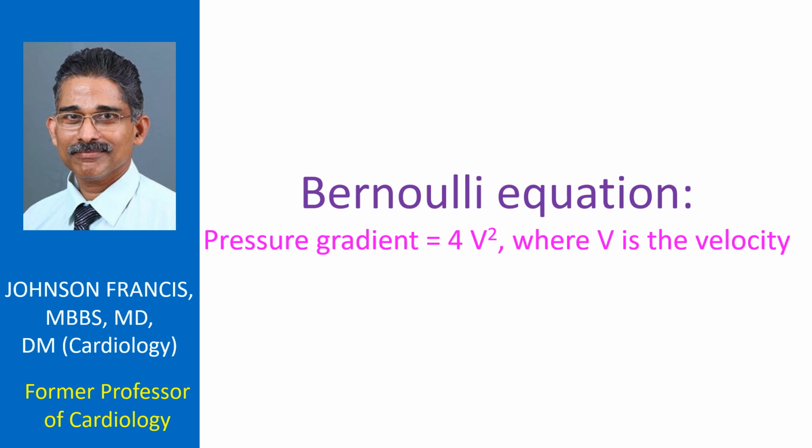The mean gradient can be estimated manually or electronically, by sketching out the envelope of the jet, and the computer program generates the mean gradient display. The gradient in this case is quite high, representing severe aortic stenosis.